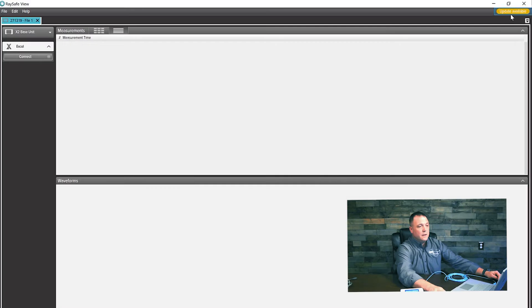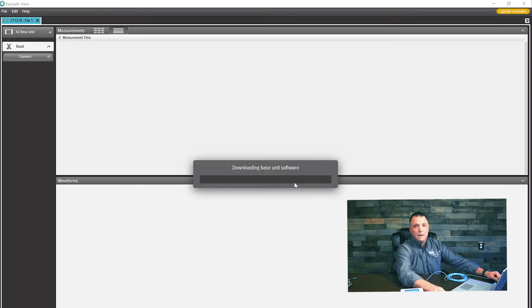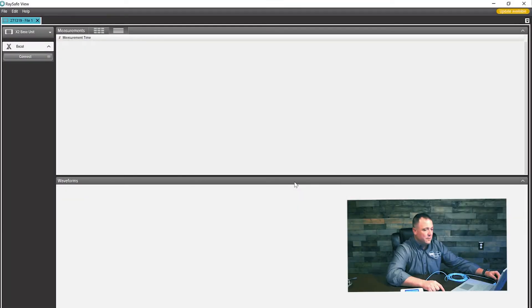Follow the prompts and now we're installing our software. We'll check back once it's done. Now you can see that we're wrapping up with our update, and we're done.